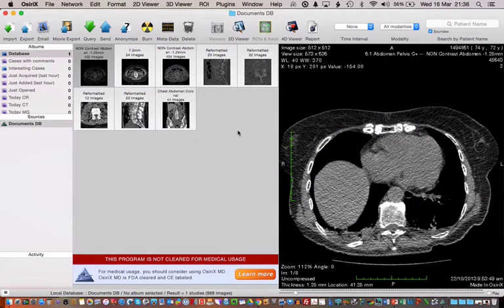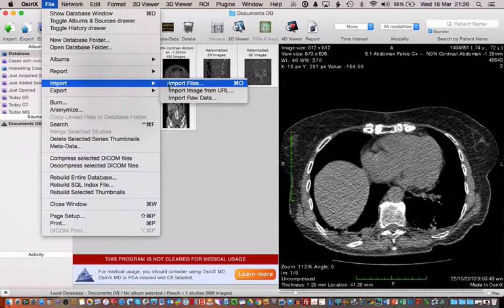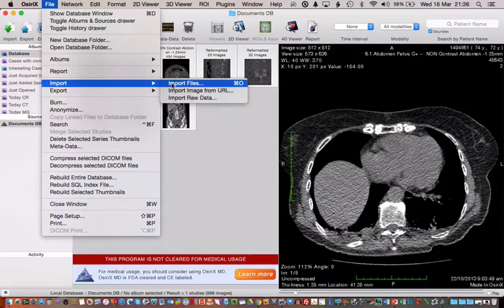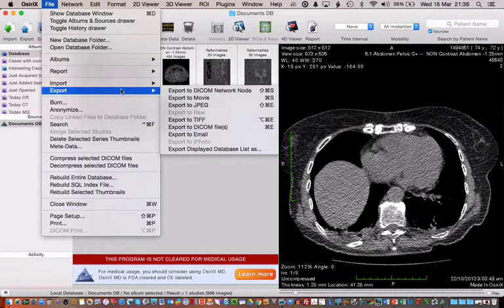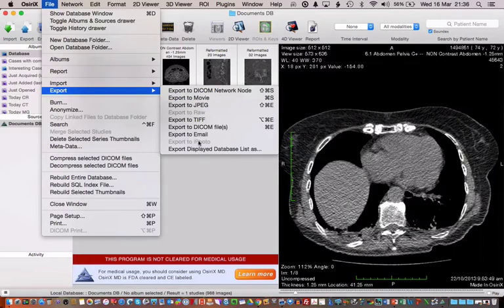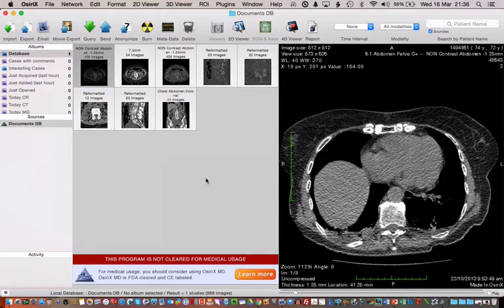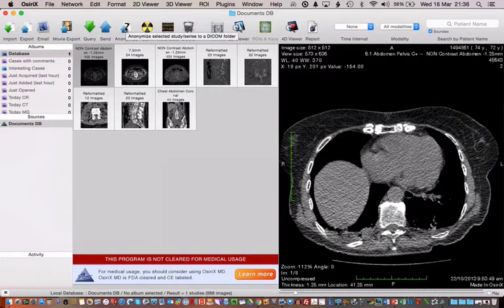So get your images, get OsiriX, basically import files and you upload your stack of images into OsiriX and then you select them and go to export to JPEG. And that's as simple as that. If you need to anonymize them you can strip all the identifying information off.